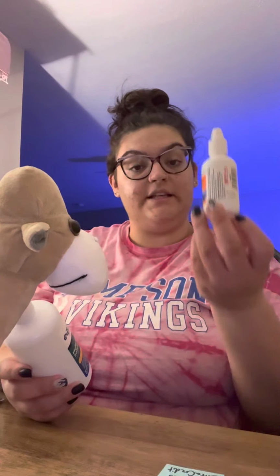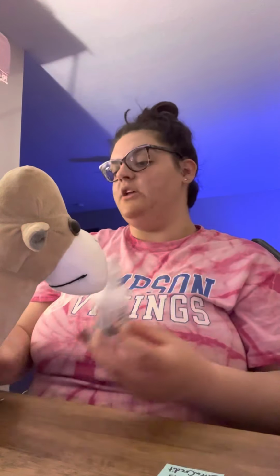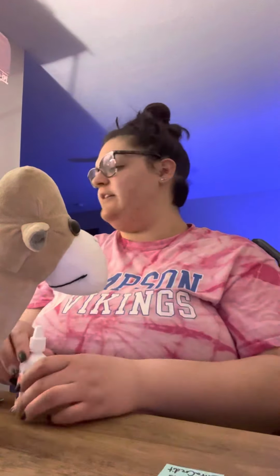So then we're going to walk into Cam's room. He's going to give me his full name and his date of birth. Cam the Camel, April 1st, 2001. And I'm going to administer his nasal spray first. So I'll have Cam spray his nose for me.